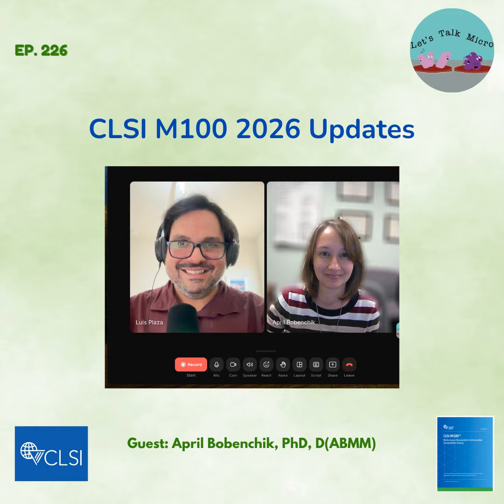Okay, and one thing that you mentioned was a lot of the changes was regarding aztreonam avibactam. So there are testing recommendations and breakpoints for Enterobacterales. Can you talk more about these? Yeah, so this is a new drug that has activity against the metallo-beta-lactamase enzyme, or organisms that have metallo-beta-lactamases that are of the Enterobacterales. It's only for Enterobacterales to have the MBLs.